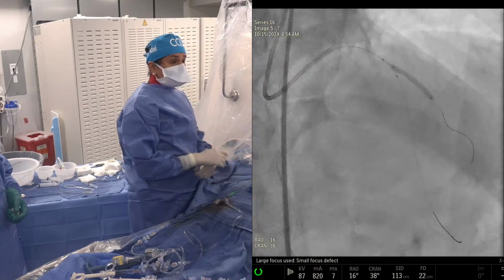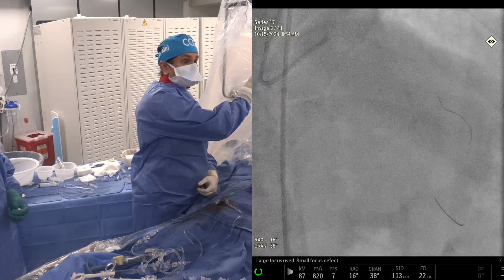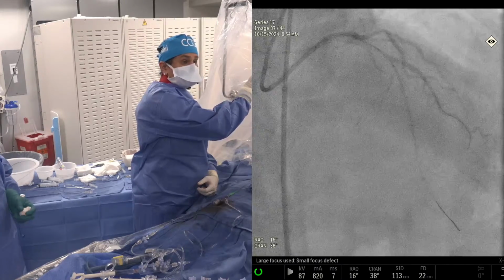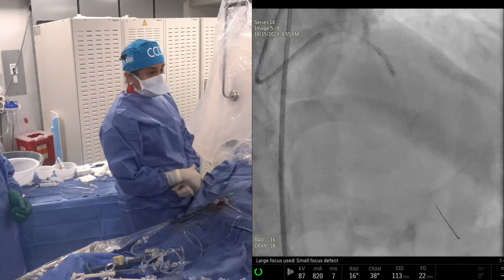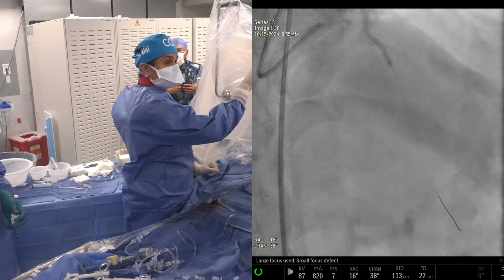So you place a side branch stent. This was at 14 atmospheres. You take it out and check that everything is okay. Again, this is fluoro-safe. We don't go on full cine. You remove the wire, and this is where you are. You crush that stent. This was 2.5. We went to 20 atmospheres.